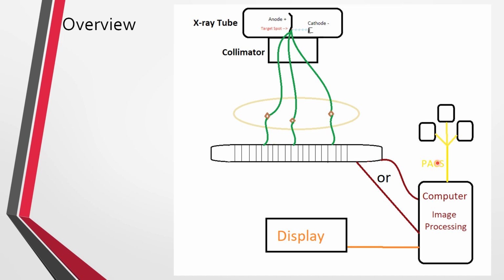So this is very interesting. The whole process is there's particles, electrons here, and that gets converted to an analog electromagnetic signal here, which is the X-rays. That goes to the detector. It's either converted into a different form of electromagnetism, which is light, and then back to electrons, back to particles essentially, which is just the electrical signal, or it can go right to the electrical signal.